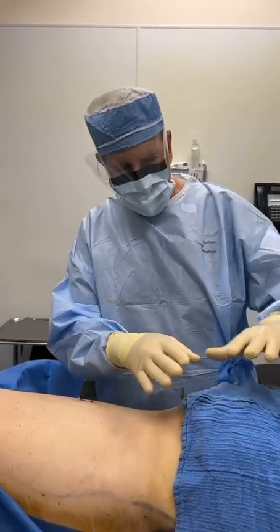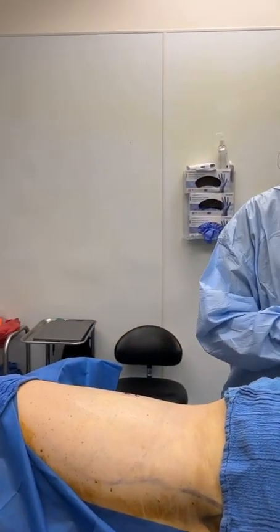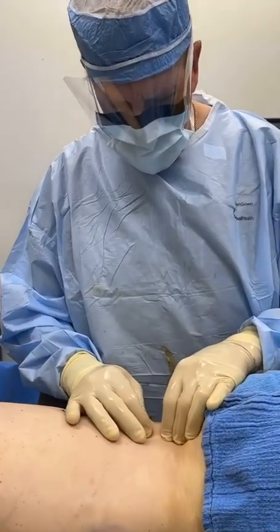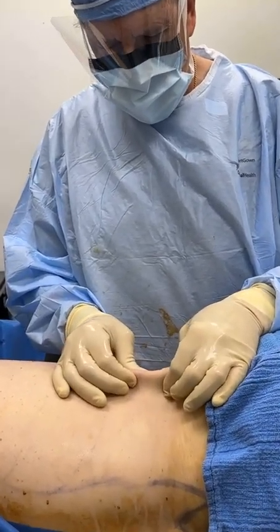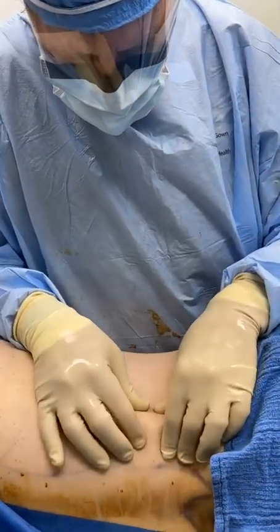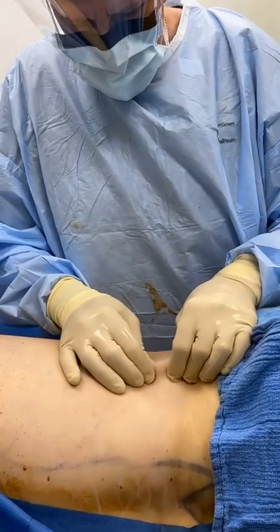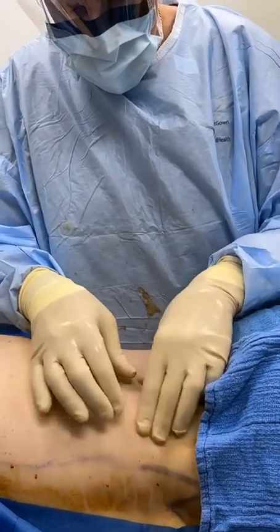Okay, so she's on her side, the buttocks are over here. We're gonna do a fat transfer to the buttocks, but what I want you to see is that I'm gonna do what is called the pinch test, and notice this. See, when I do this, see how there is absolutely no excess fat here. This is part of the surgery. We want to make sure that it is even, even Steven, right? See, everywhere, and even here. You want to do this in a nice way so that there is no excess fat.